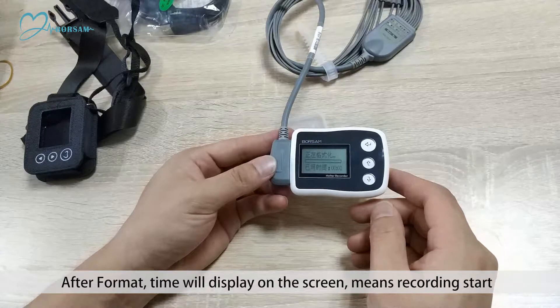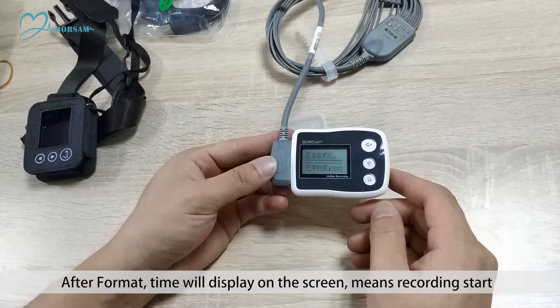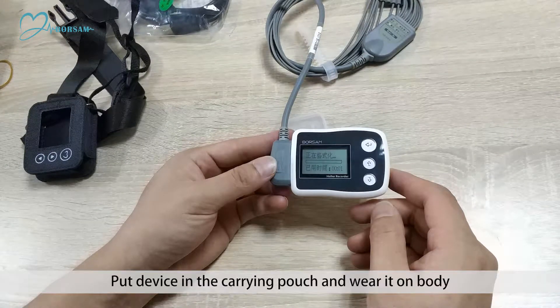Step 11: Formatting disk. After formatting, the time will display on the screen, which means recording has started. Step 13: Put the device in the carrying pouch and wear it on the body.